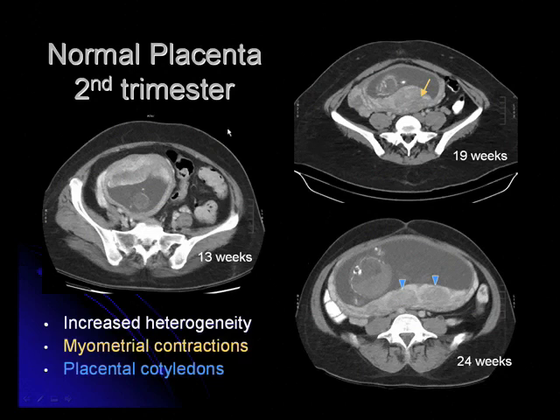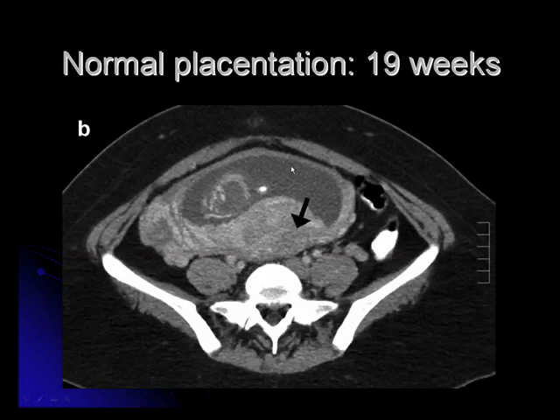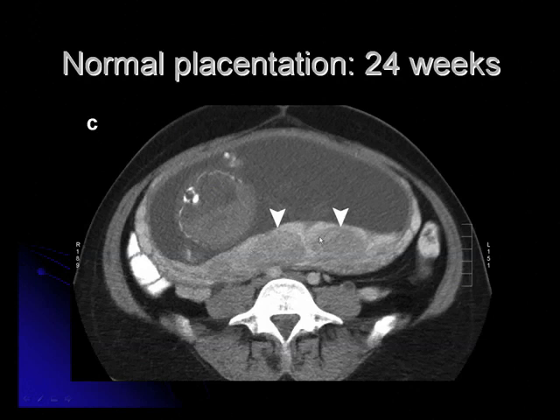These are some examples of the normal placenta during the second trimester. Features include increased heterogeneity with IV contrast enhancement. Myometrial contractions may be seen, and later in the second trimester, multiple placental cotyledons may be seen. At 13 weeks, you can see that the placenta is already well delineated from the myometrium. The myometrium does not take up contrast as much as the placenta and therefore is hypodense to the placenta. At 19 weeks, there is an increase in placental uterine thickness caused by a contraction of the underlying myometrium. And these are the placental cotyledons.